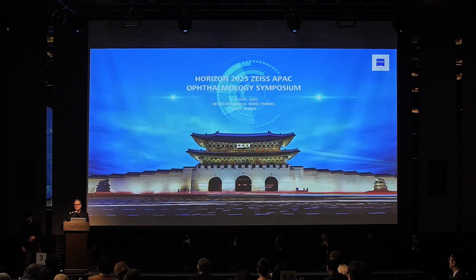I wouldn't do that. First of all, it's still the sensitive period where you can create some cystic macular edema. And the other thing is, if there is nothing to YAG laser, I wouldn't do it. You can sometimes have situations with posterior capsular folds, which are annoying, and where you have the impression that this contributes to some problems. Then of course you can do the laser, but not before, let's say, 4 to 5 months after surgery, in order to prevent any macular issues.